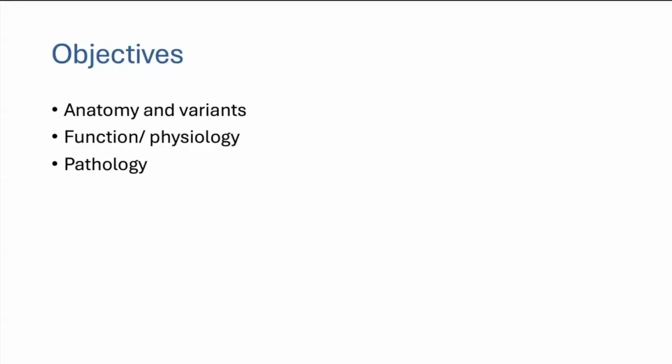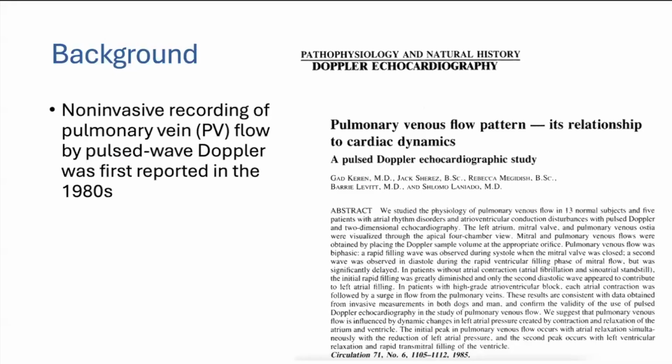First thing, I'll talk about the anatomy and some variation in the pulmonary vein anatomy. I'll talk about the function and physiology of the pulmonary veins, as well as some pathologies and how they affect the Doppler waveform.